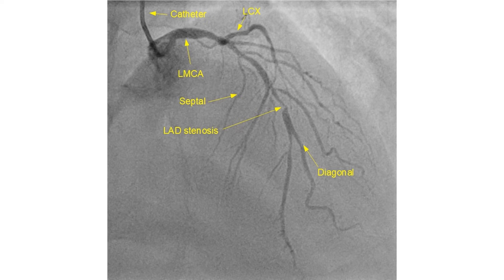There is mild stenosis of the distal left anterior descending coronary artery after the origin of the terminal diagonal. The terminal diagonal and distal LAD beyond the bifurcation are almost of the same size. The terminal diagonal is free of significant disease.